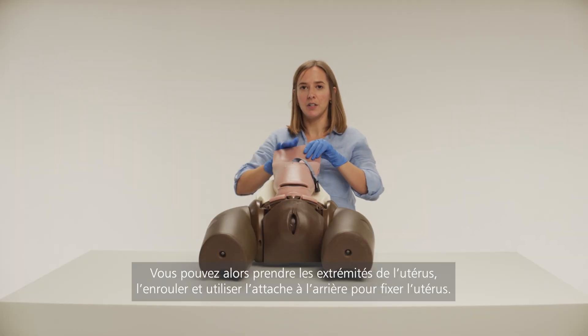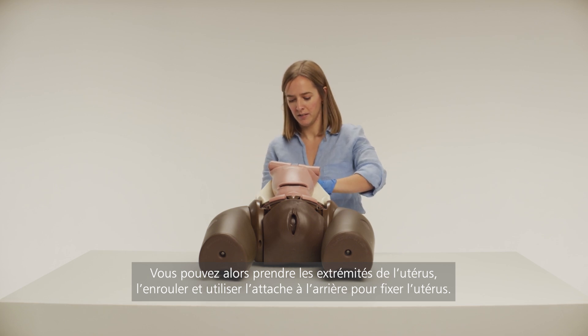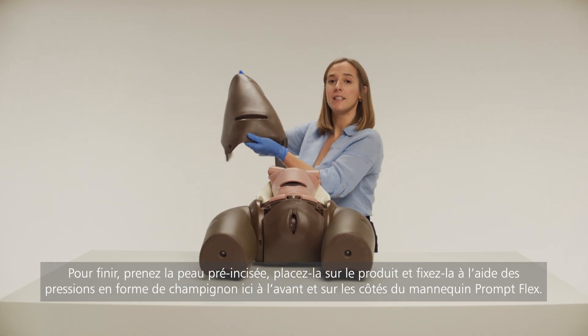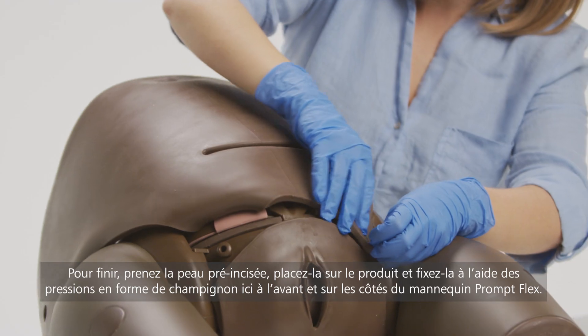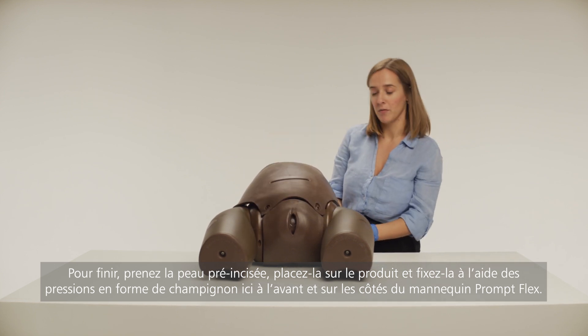You can then take the ends of the uterus, roll it up, and use the clip here at the back to secure the uterus in place. Finally, take the pre-incised delivery skin, placing it over the product, attaching it via the mushroom-shaped poppers here at the front and sides of the PromFlex model.